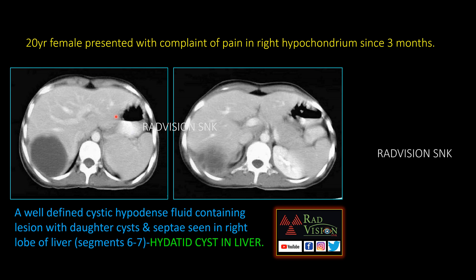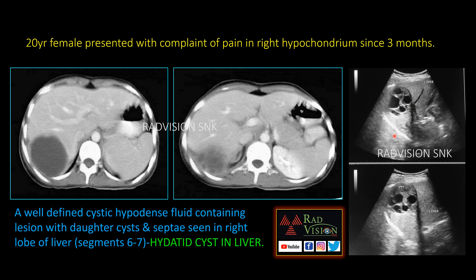Coming to the first case: a 20-year-old female presented with complaints of pain in the right hypochondrium. You can see there is a cystic lesion in the right lobe of the liver with few daughter cysts in segments 6 and 7 of the liver. This is a typical hydatid cyst in the liver. Here is another case showing a typical hydatid cyst with multiple daughter cysts noted in the liver on ultrasound. This is the typical appearance of hydatid cysts in the liver on ultrasound.